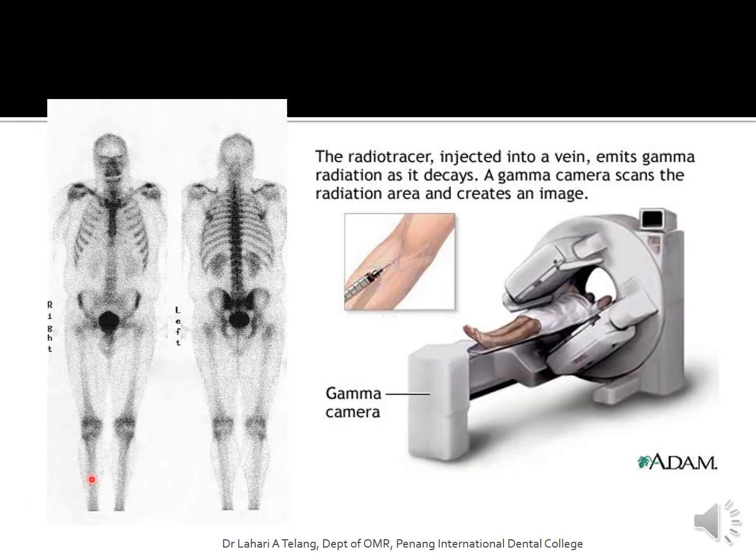So essentially what happens is when the dye is injected into the body and the patient is inside a huge gamma camera, similar to the scanner used in a CT or an MRI scanner, the dye gets concentrated in all parts of the body. Based on the area where it is accumulated, the imaging modality helps us detect the function or the defect in that particular area.